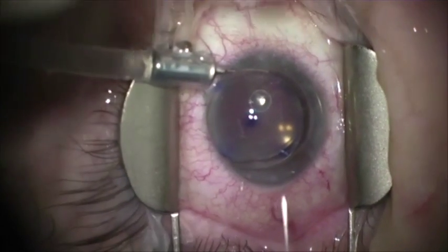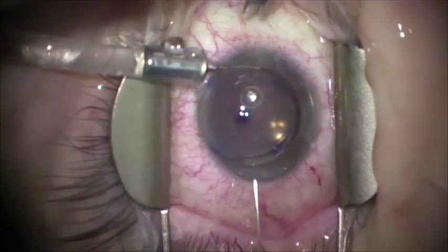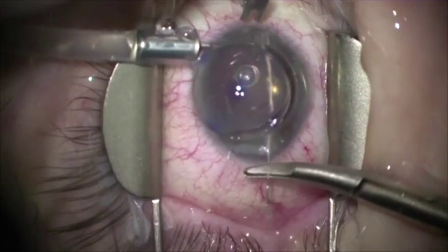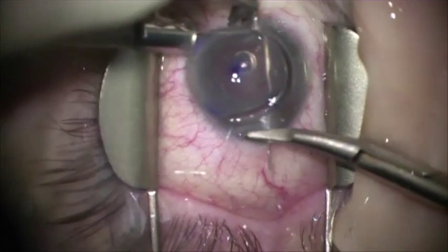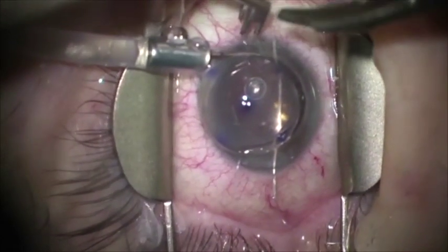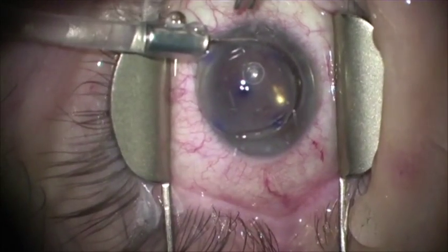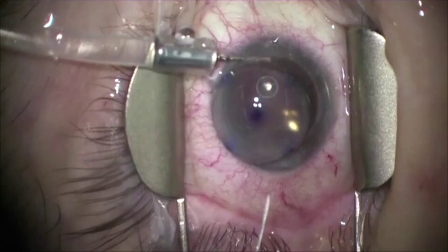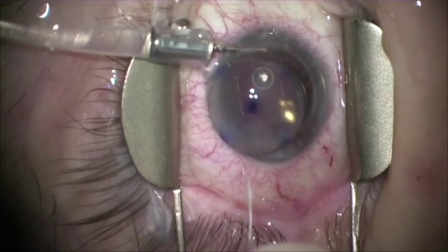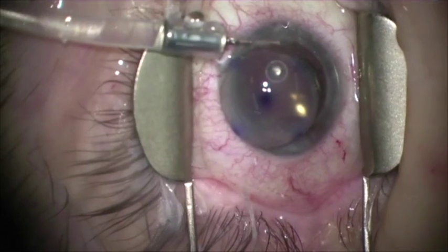The double-arm sutures are then passed through the anterior chamber, which is being maintained by the anterior chamber maintainer. It's important that the spacing of the sutures through the recipient cornea be at least as big as the space that they were placed in the donor. If it's less than that, folding of the graft will occur. If it's somewhat larger than that, that generally works out fine, as it will pull and stretch the graft into position.